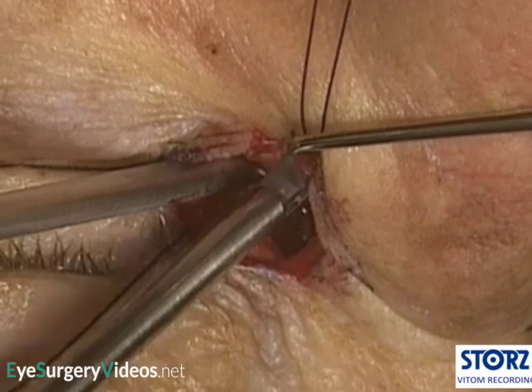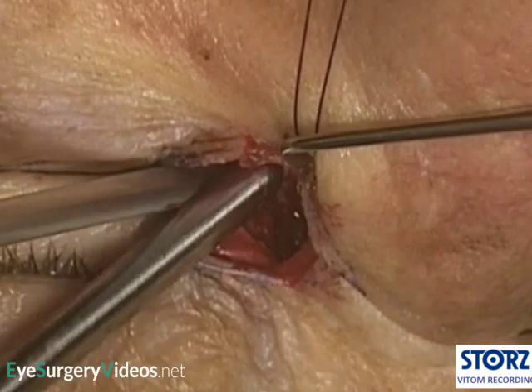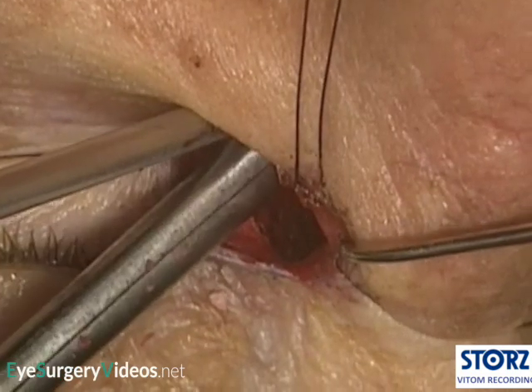The lacrimal bone, including the posterior lacrimal crest, some of the frontal process of the maxillary bone, including the anterior lacrimal crest, and the anteriormost lamina papyracea will all be removed. The precise dimensions and location of the ostium are difficult to specify and vary from patient to patient and surgeon to surgeon, but some general guidelines are: 1. The entire lacrimal sac must be exposed with space for the lacrimal sac and nasal mucosa flaps to be opened fully.